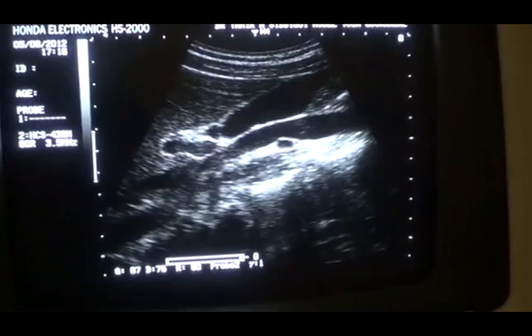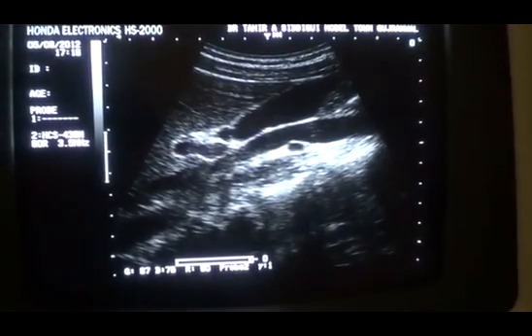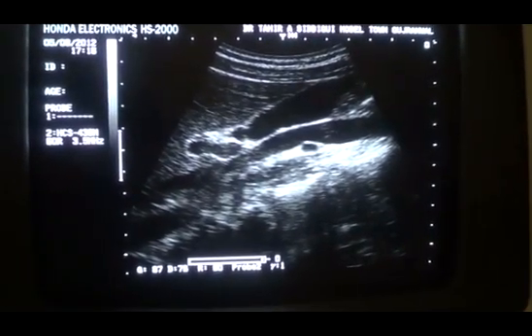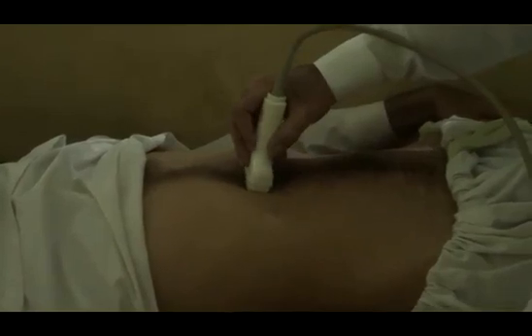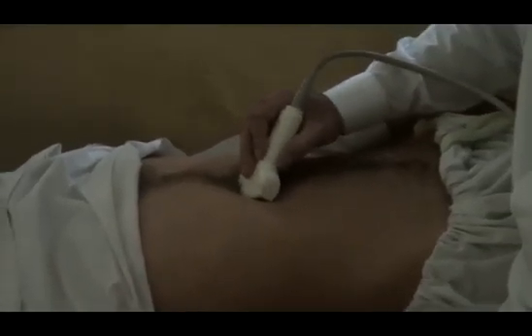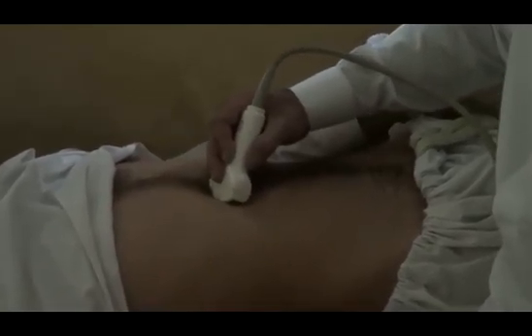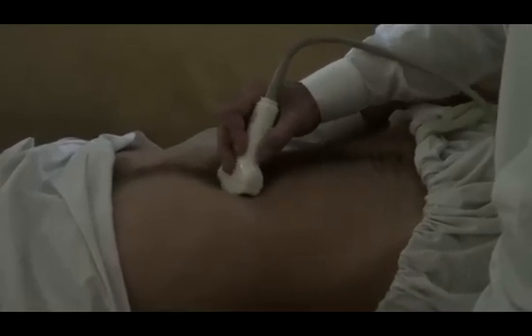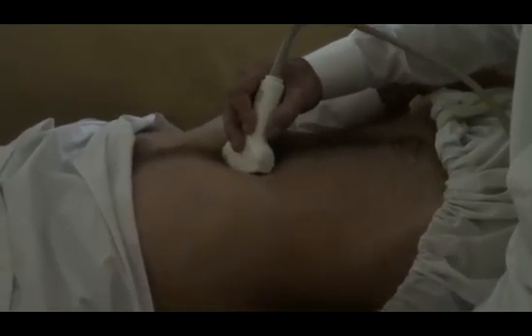There is another scanning plan — when the patient is in supine posture. If you place the probe in the epigastric region — this is the xiphoid process, this is the epigastric region — angle it and you will be able to locate the gallbladder. From here you angle it towards the patient's right side, then angle it towards the patient's right shoulder. If you feel difficulty, ask the patient to take a deep breath. Most of the time this is the area from where you get the gallbladder.